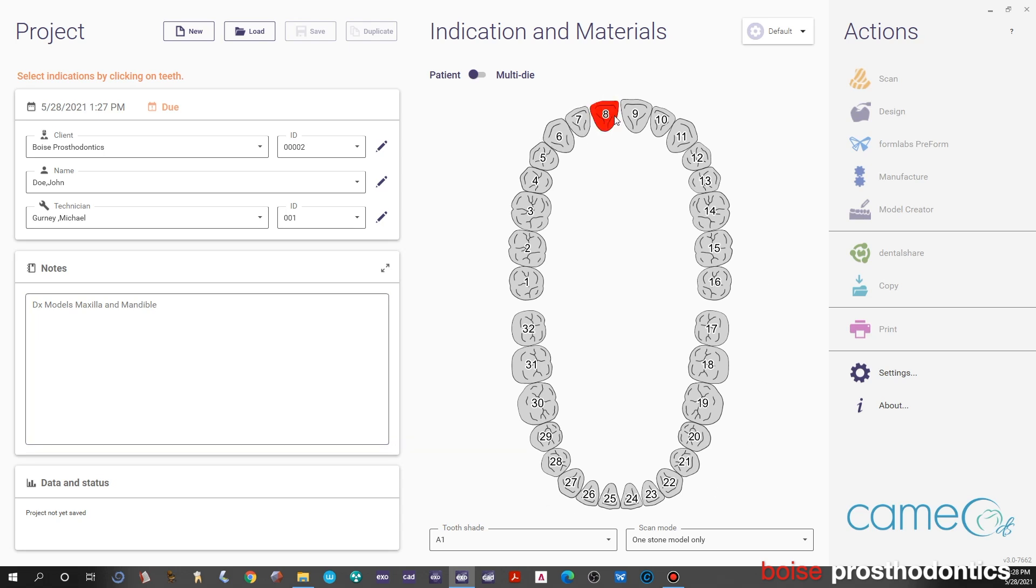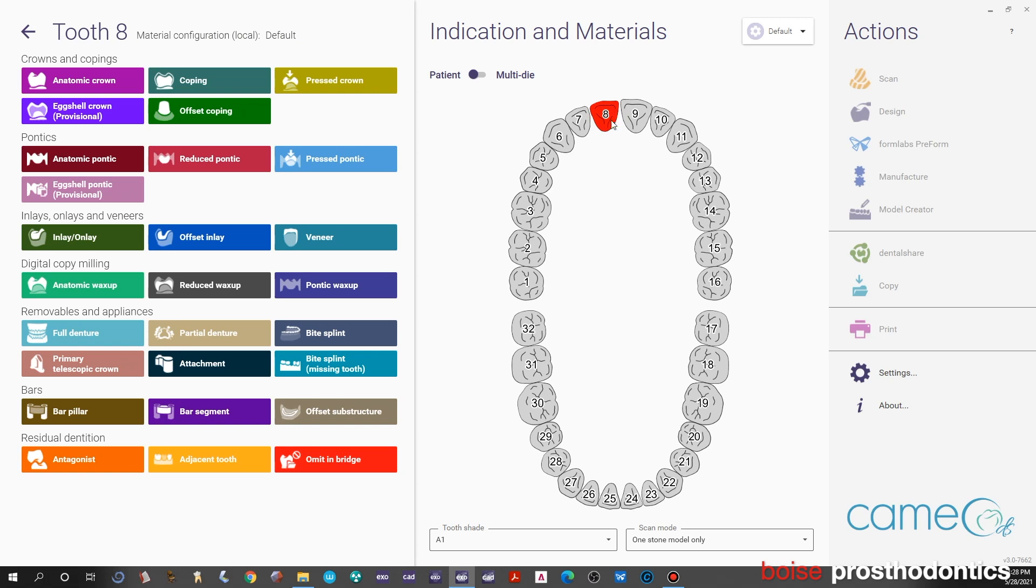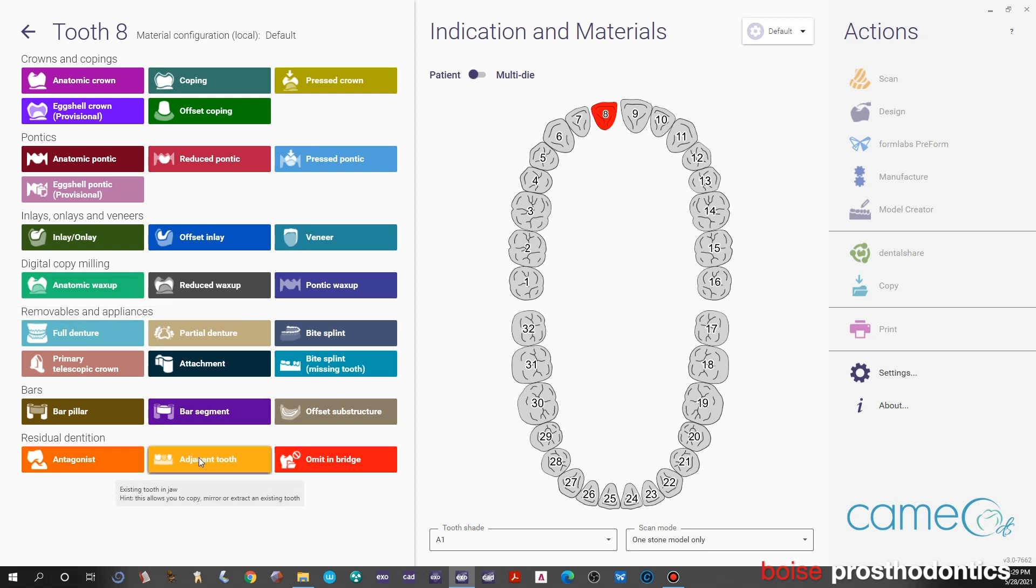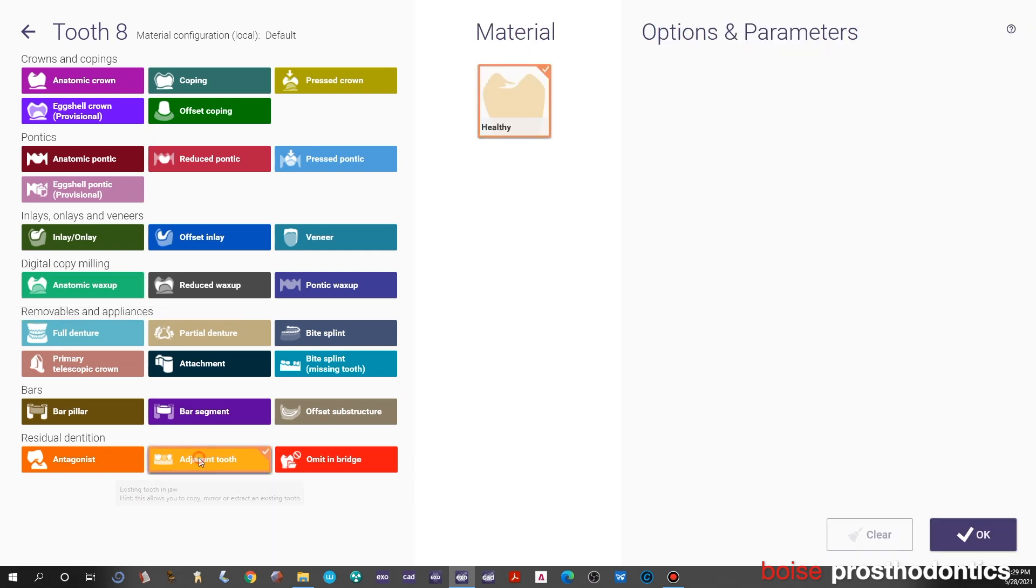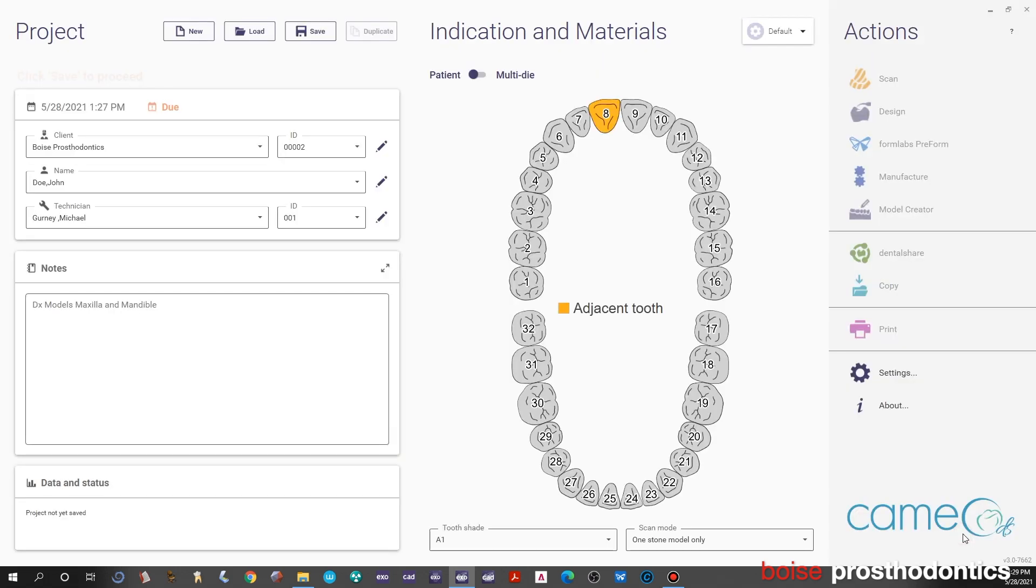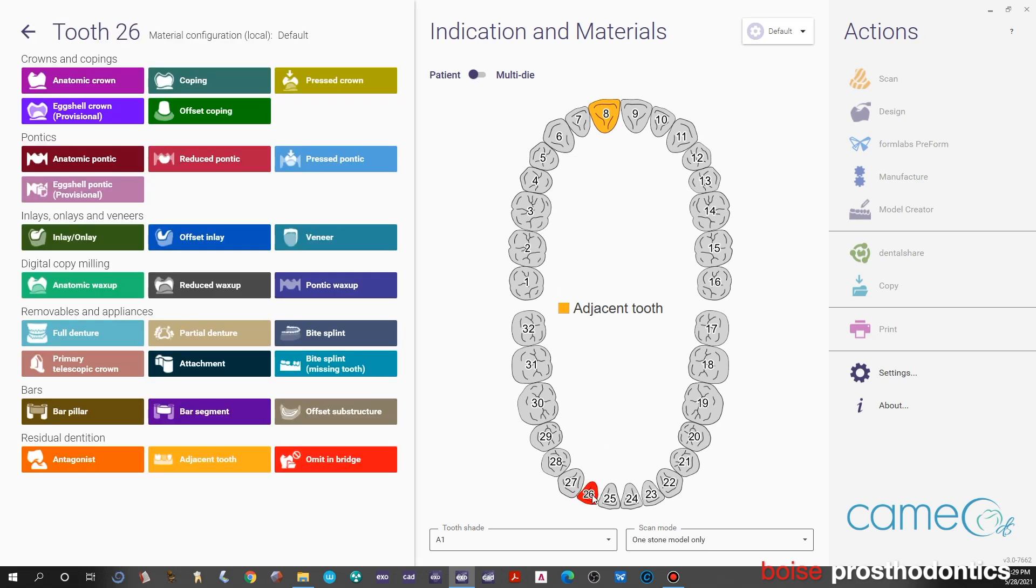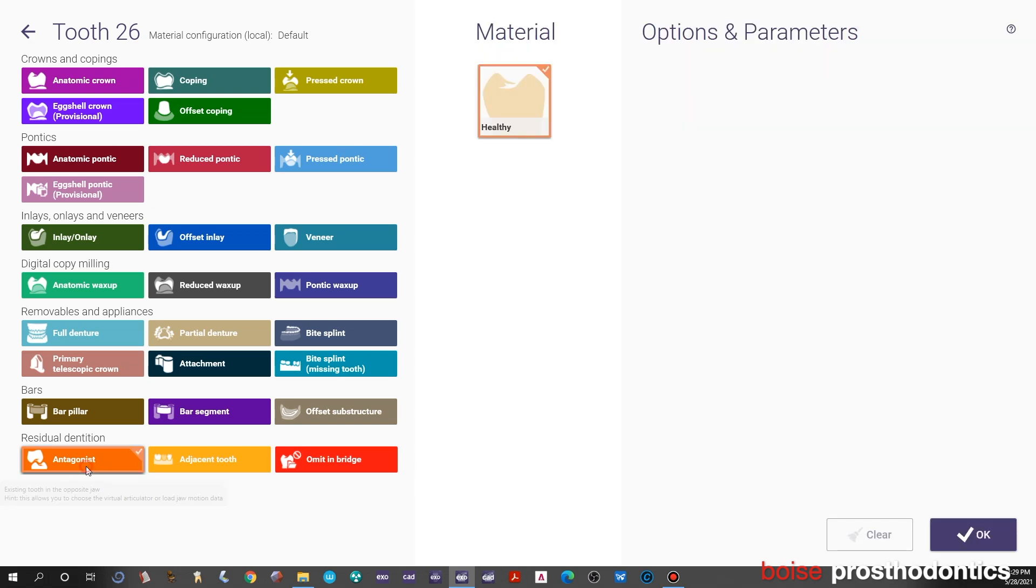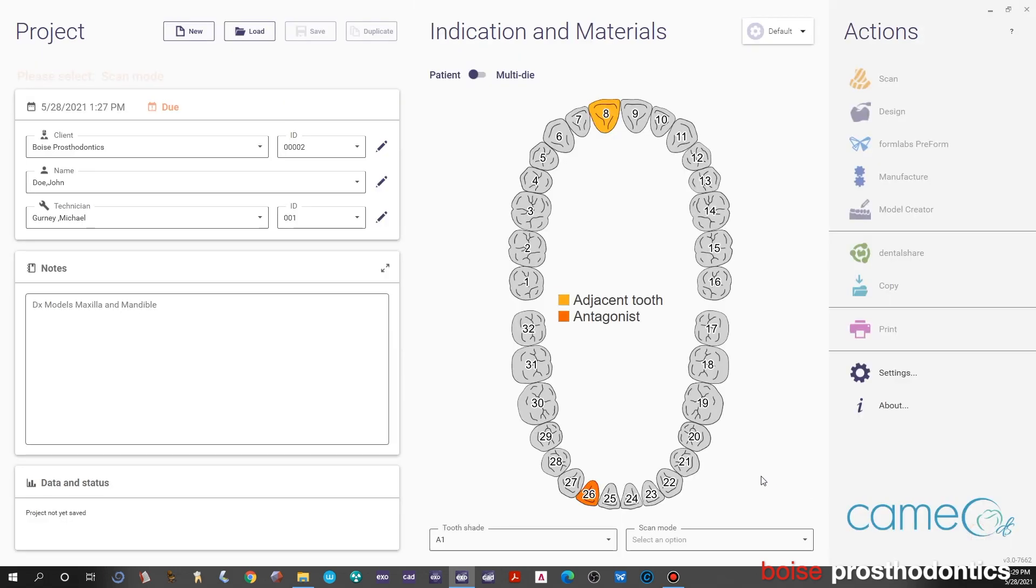Left click a tooth and you'll have this selection of things that we can do in Exocad. This is pretty straightforward—we're just going to click on adjacent tooth and then click OK. Then any tooth in the lower jaw, we will left click and this time choose antagonist and click OK.